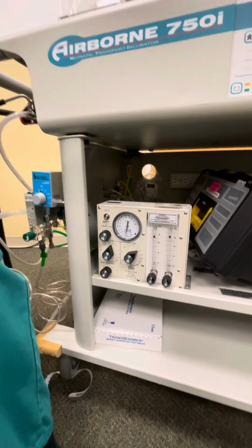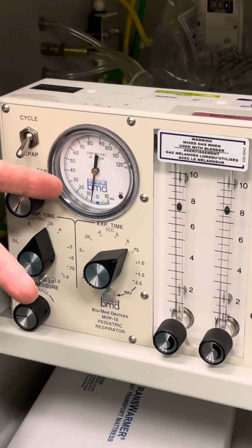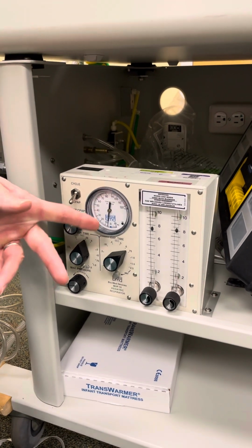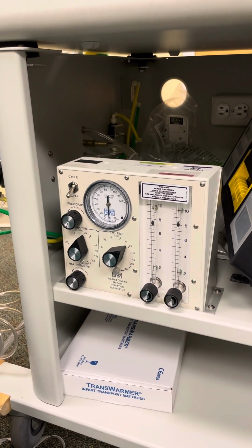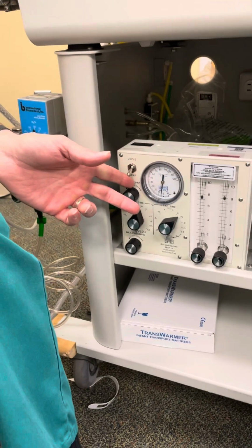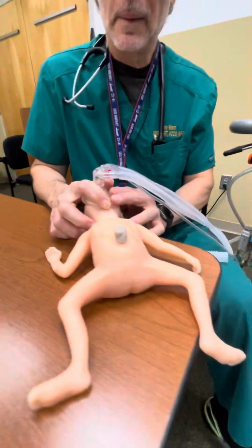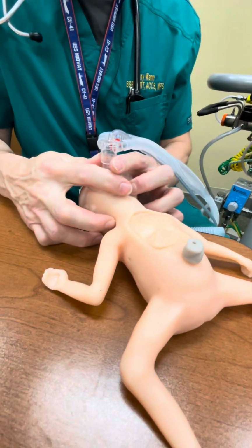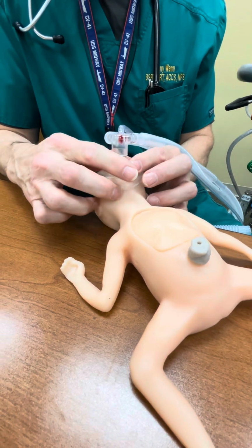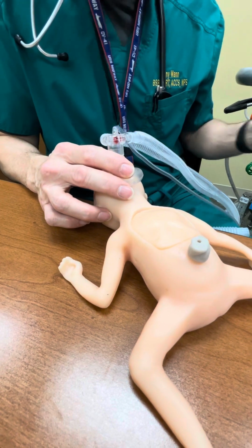Now, of course, you can't ventilate like a Neopuff by covering the little hole for the inspiratory pressure on the Neopuff, but you can get CPAP. Now, have I ever gone to cycle mode non-invasively with a kid? I have tried it. It works. As you see, right now, I'm doing CPAP. I'm not intubated here. So I'm trying to replace the function of a CPAP with a ventilator circuit using the Airborne, but it works.